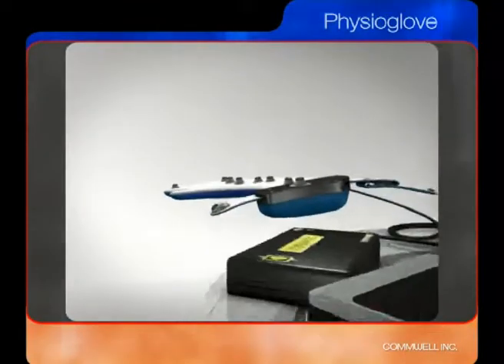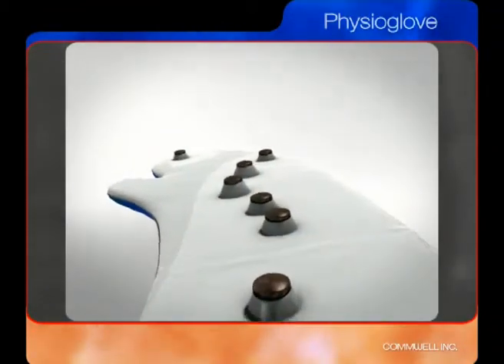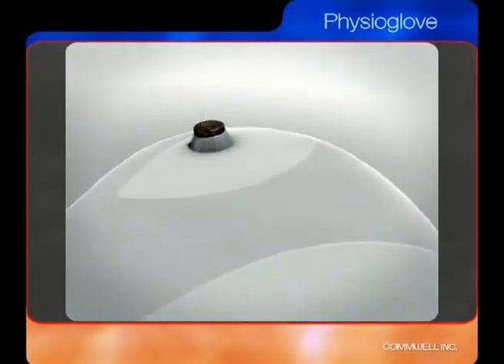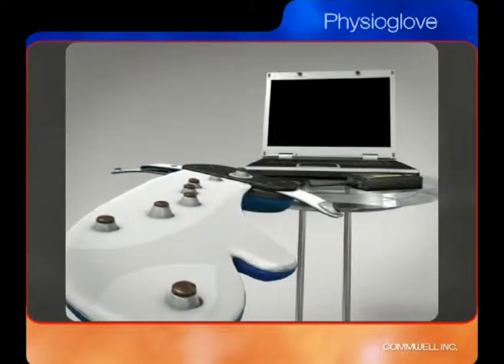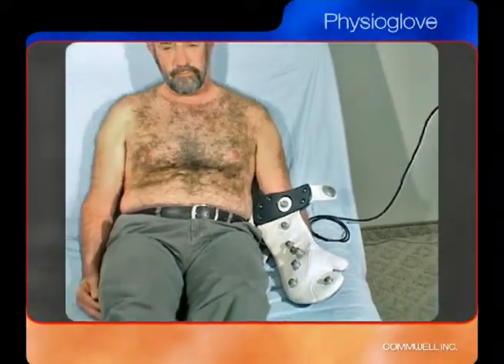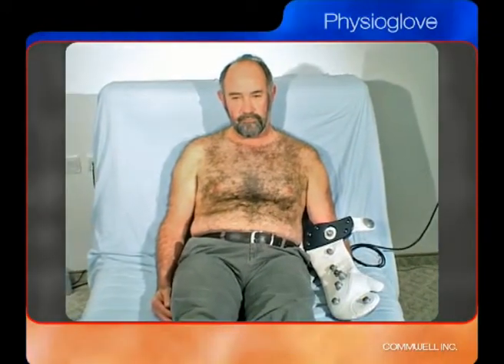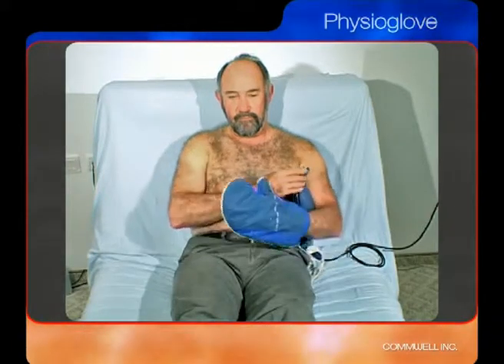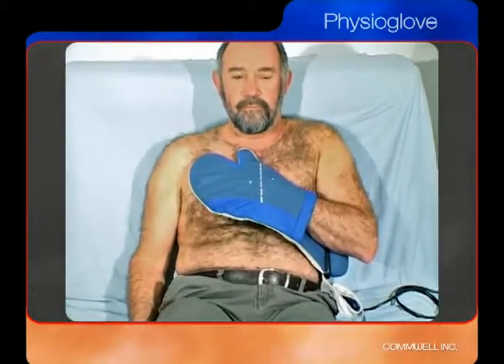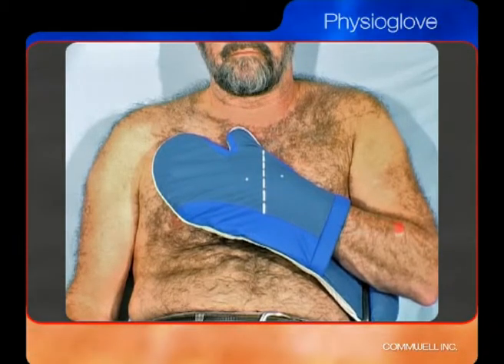The Physioglove incorporates all 10 required electrodes in the glove itself and connects to the ECG machine using a single data cable, thereby eliminating the clutter of 10 separate cables. The Physioglove provides a natural alignment of the location of the electrodes using a glove positioned on the left arm of the user. When the user places the left hand on the chest in a pledge of allegiance fashion, the hand and the lower arm naturally align with the correct anatomic positions required to measure the chest leads of the 12-lead ECG.